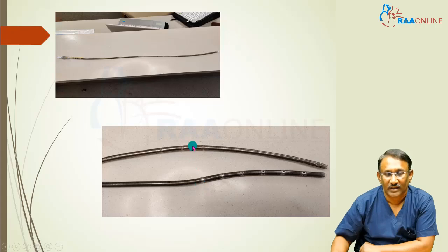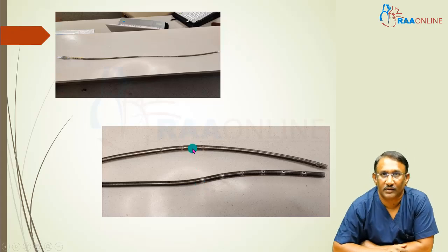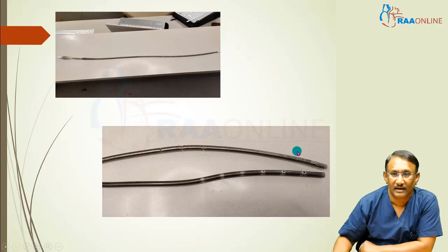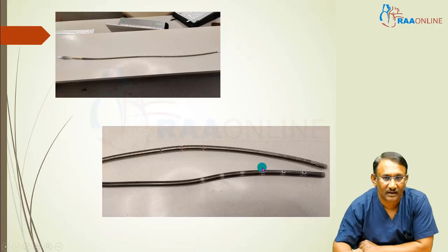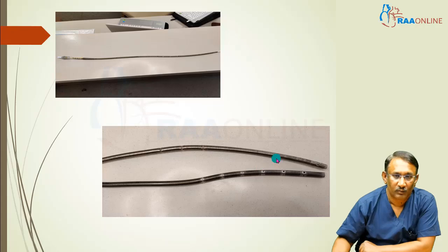So you need to know very clearly what type of cannula you are using, what the hole configuration is, and that should suit your requirement. Suppose with this cannula, you can place this part in the SVC and this part in the IVC. Nothing will be in the RA. So effectively this can drain for a veno-venous very well. Whereas you cannot do the same with this cannula because there are holes in between. If they are in the RA, they keep sucking and that leads to the problem of recirculation in the veno-venous ECMO. So one, you need to know the location of the holes.